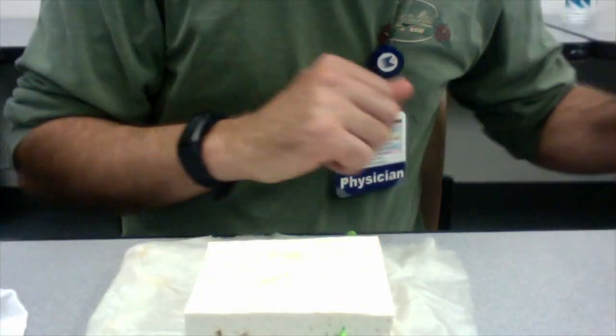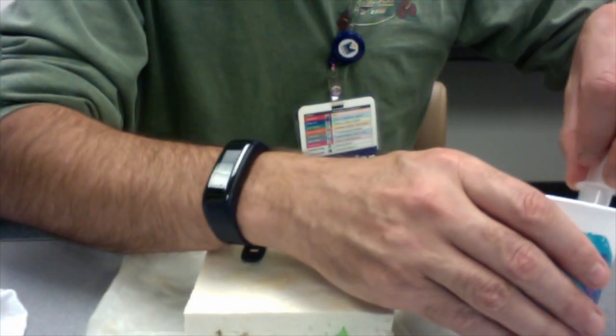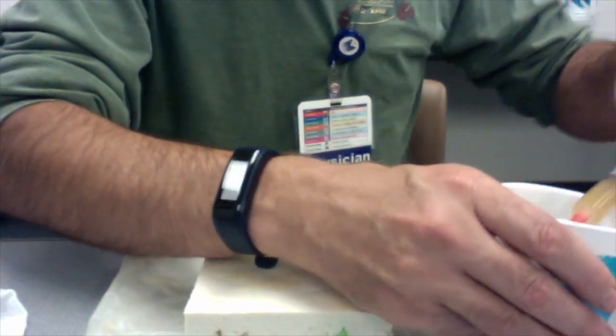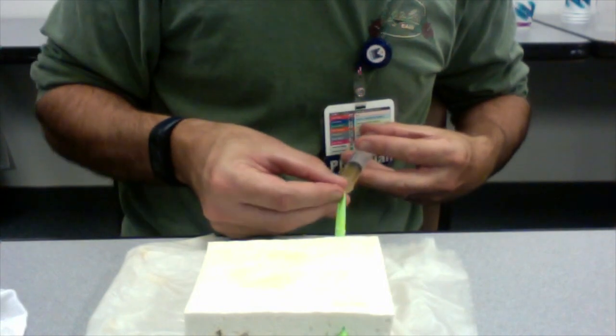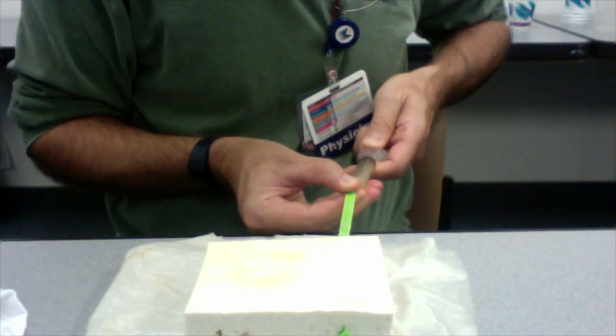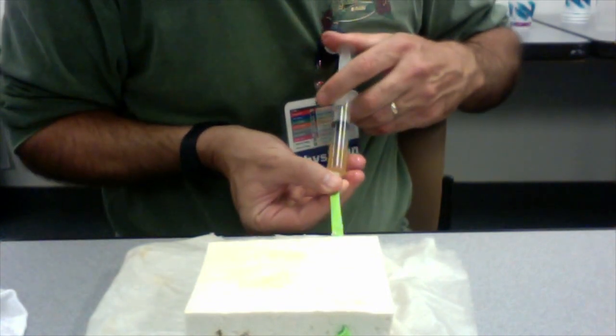Once that's done, draw your water up into a syringe and inject it into the balloon. You've got to make sure and draw all the air out of the balloon first — you don't want any air. That's the enemy of ultrasound; it's going to throw off your image. So suck out the air, make sure the balloon comes to the top, and then put the liquid into the balloon.